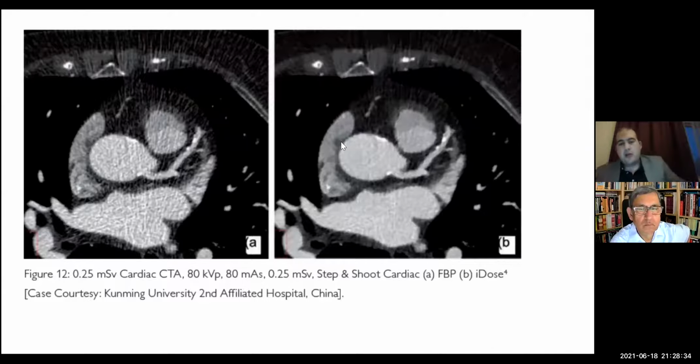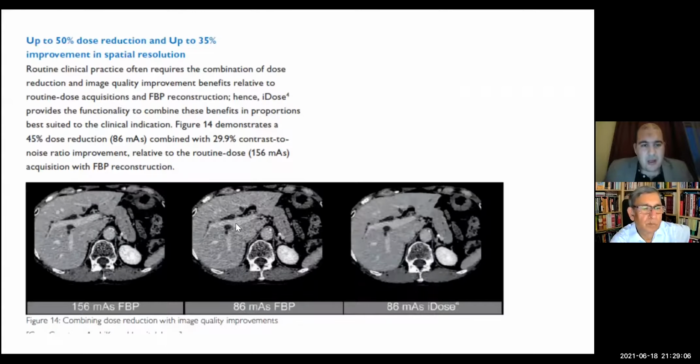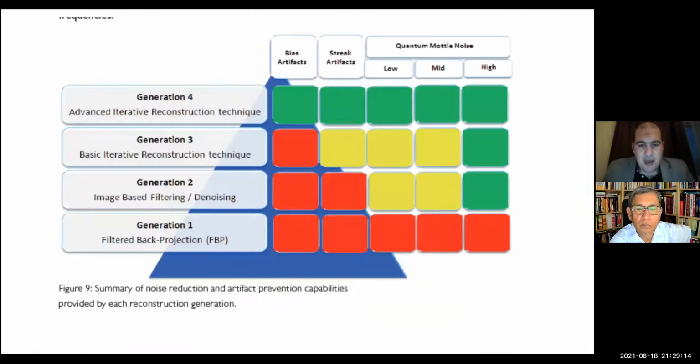You have to contribute, with your radiologist and technician, to design the protocol for reducing the patient dose and to get a proper image quality, also using fourth generation, which improves the contrast-to-noise ratio of the image, reduces the noise, increases the contrast, and also increases the spatial resolution, which is important for coronary arteries to detect any plaques in the coronary arteries. So you can go through the presentation, and if you need to ask any question, I welcome everyone to ask me anytime. I'm so happy to be with you.